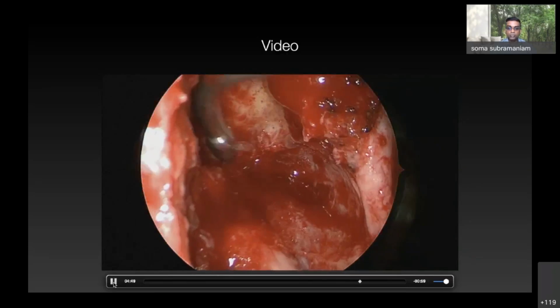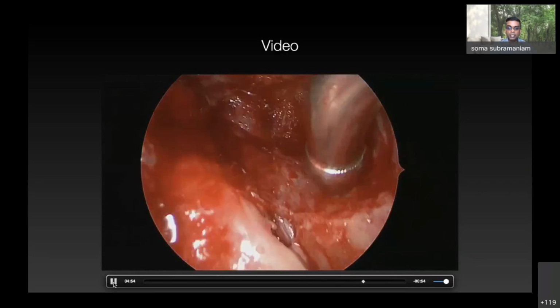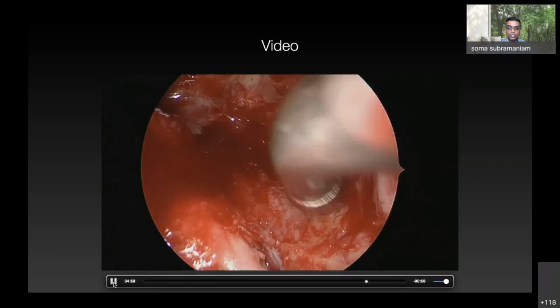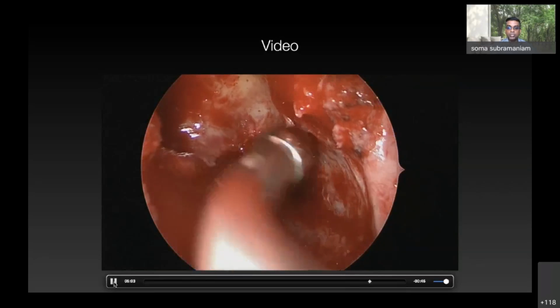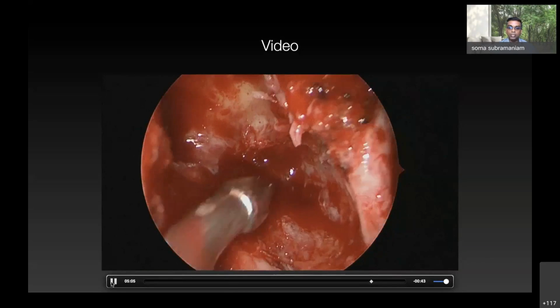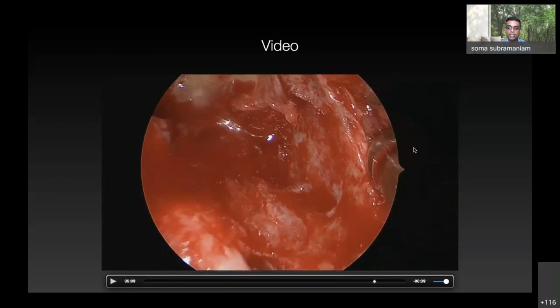All right. So once most of the drilling is done, you can start to see a little bit of venous bleeding coming out through there, and that's from the pterygoid venous plexus. All that is actually nasopharyngeal mucosa, not much bone, not much disease left behind. So this procedure is now completed. And this here is actually the descending palatine artery, completely exposed but covered in its mucoperiosteum. Okay, so that's the junction of the pterygoid, and just lateral to that will be the infratemporal fossa.